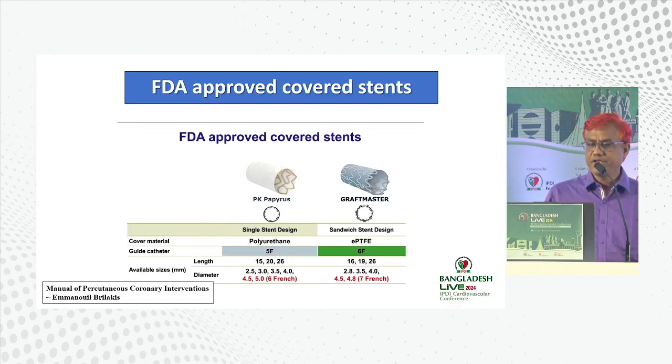This is the FDA approved cover stent. There are 2 types of cover stent, that is single stent design and sandwich stent design. In our country, we usually use the Graftmaster.